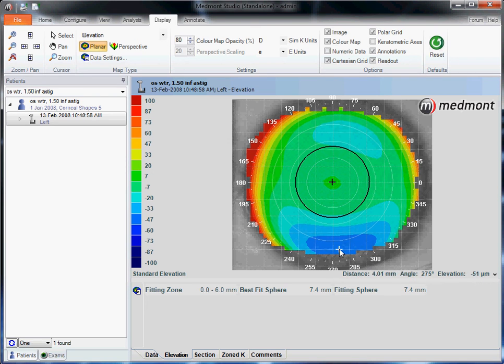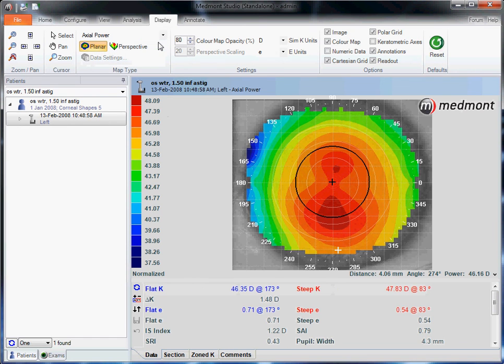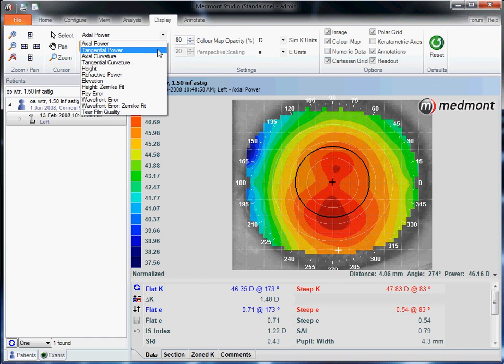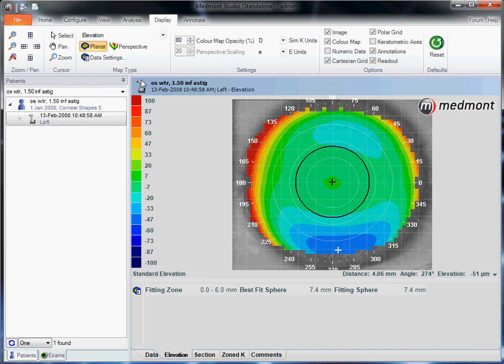Clicking our cursor in the blue, the elevation of the eye is lower than the sphere. So what this tells us is that an RGP dropped on this patient's eye is going to hit where you see the reddest contour at 3 and 9 o'clock, and it should lift the most down at 6 o'clock where the eye drops in elevation the most. So to summarize: axial for power, tangential for shape, and elevation for the height of the eye.